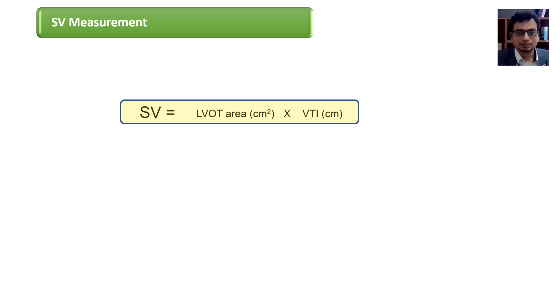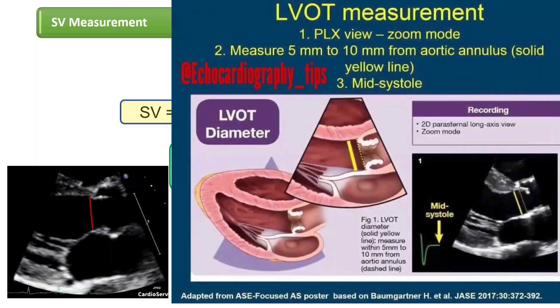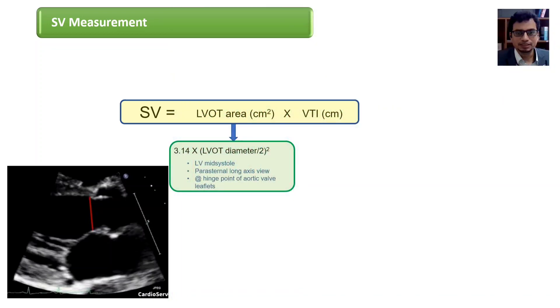LVOT diameter is calculated in LV mid systole: freeze the view at mid systole and at the hinge of aortic valve leaflet measure the distance from inner edge to inner edge. From LVOT diameter LVOT area is calculated using formula pi r square. Now LVOT diameter should be measured correctly as any inaccuracy in the diameter measurement will be squared.